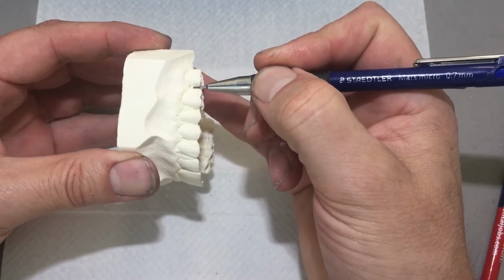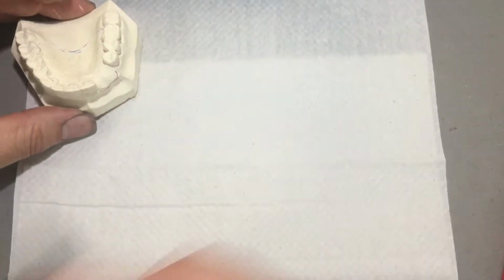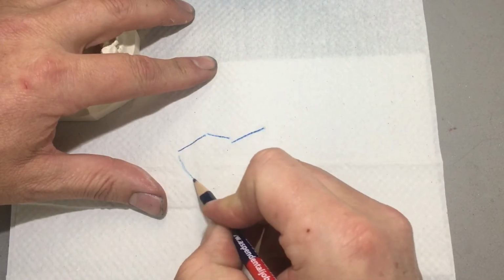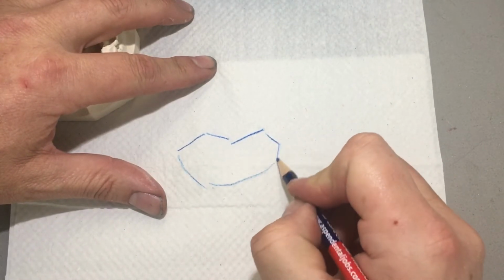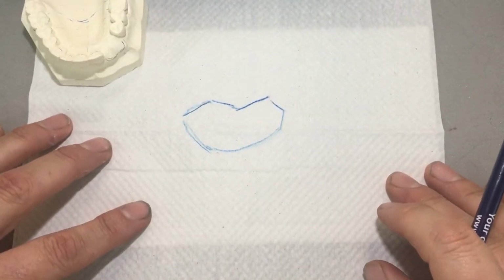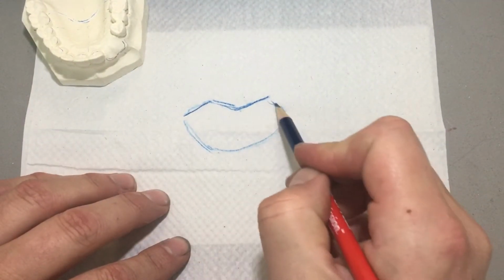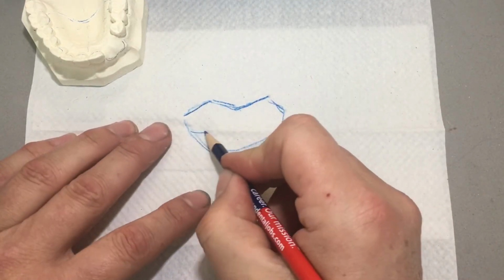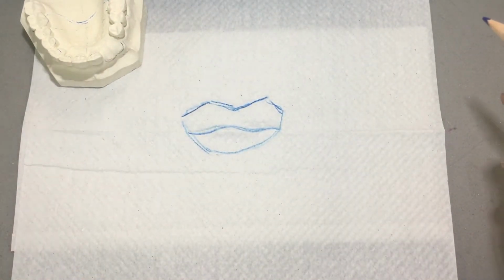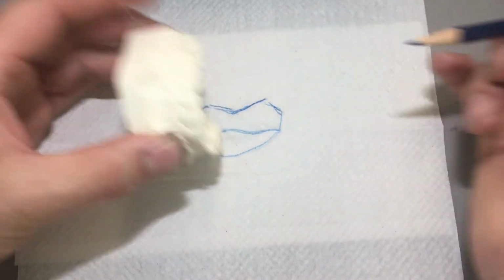And on this side, I'll do the same, just with a lead pencil. If I draw this molar on, can we simulate that this is a beautiful looking number 6 molar? You can visualize this as a molar. So we've marked the height of contour like this, and that could be roughly done here without using a surveyor. We just held the model perpendicular to the plane of occlusion and we marked the line here.